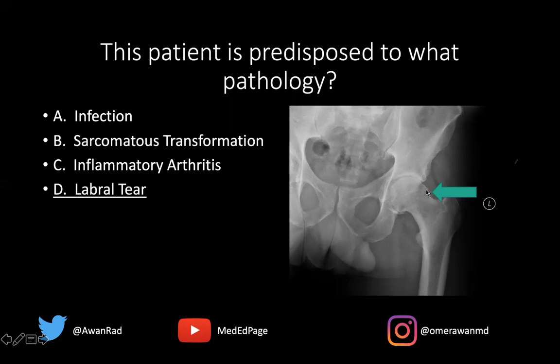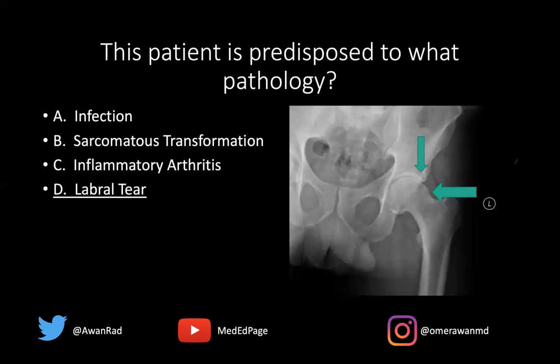This is known as CAM-type femoral acetabular impingement. Notice also that even though this patient is very young, in their 20s, they have this lack of offset at the femoral head and neck junction. They've already developed subchondral cystic change along the superior lateral acetabulum, which would be very abnormal for someone 25 years old. There is already a moderate amount of joint space loss along the superior lateral acetabulum.